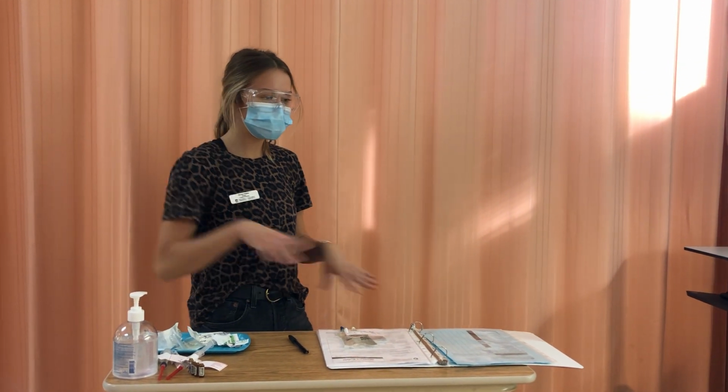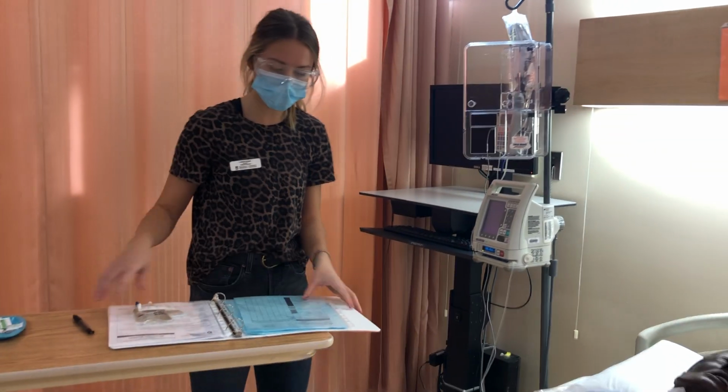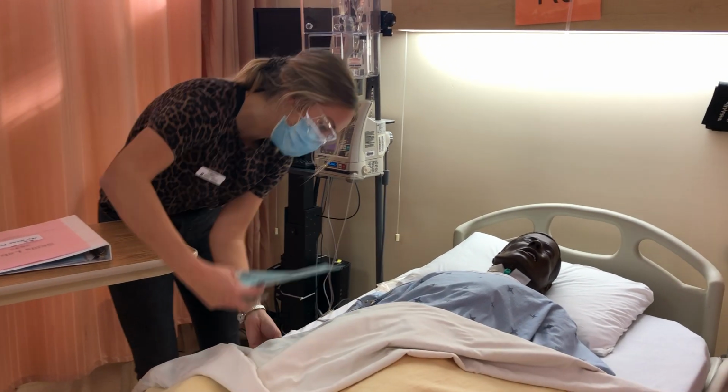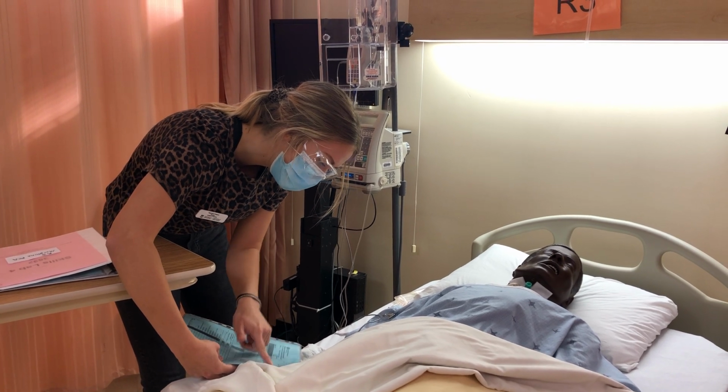So knock, knock, knock, doing a general check on my way in. Hi, my name is Hannah. I'm a student nurse looking after you today. Before I proceed, I'm just going to do one last check of the wristband here. So I have Marcy Paris, FIN number 123 123 456 456 789 789.